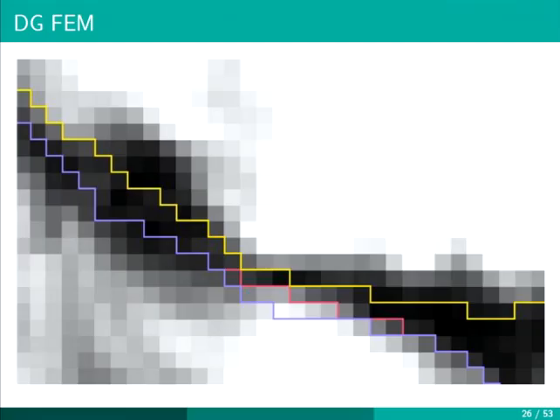One first idea would be to manually modify the segmentation. So instead of this purple line here, we will have the pink line, but manual correction of segmentation is tedious, prone to error, and takes a long time, so we would like to avoid that. Still, it would be nice to directly use the information of the MRI that is voxel based.